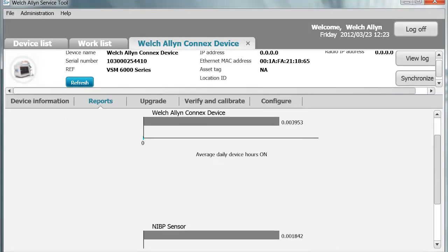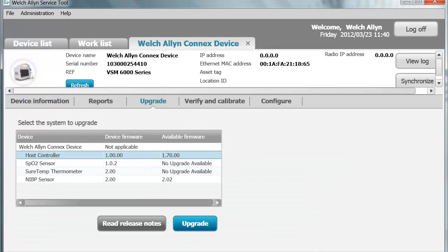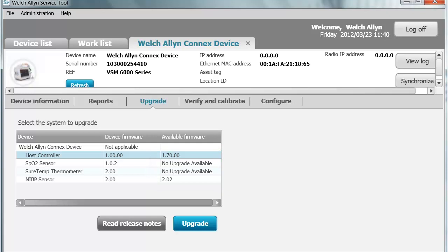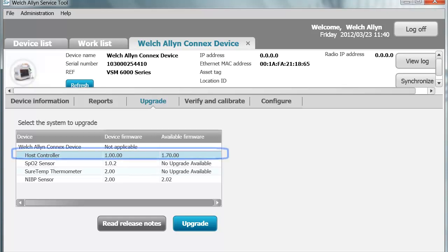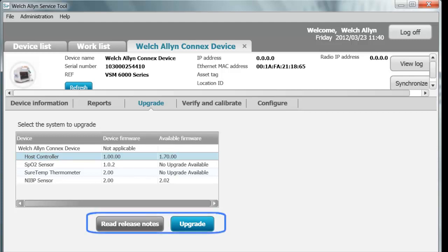When you go to the Upgrade tab, you can see the Connects device, its modules, and associated software versions. If a software version is available, it will show here. This is delivered through the Partner Connect system down to your PC. Whether the device is connected or added to the Maintained Device List, it will deliver automatically and notify you in the work list. This device has an upgrade available for the host controller. The SPO2 and SureTemp do not have upgrades. When you highlight the row where an upgrade is available, you have two options: Release Notes and Upgrade.